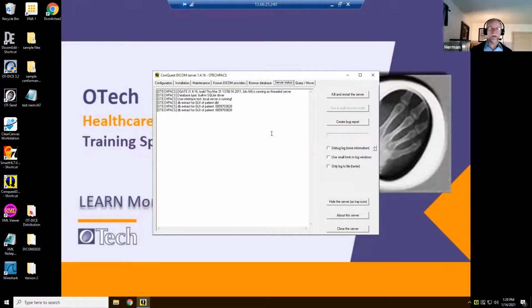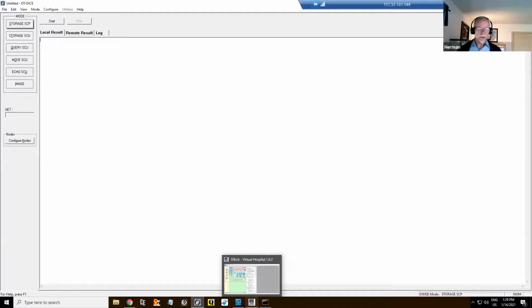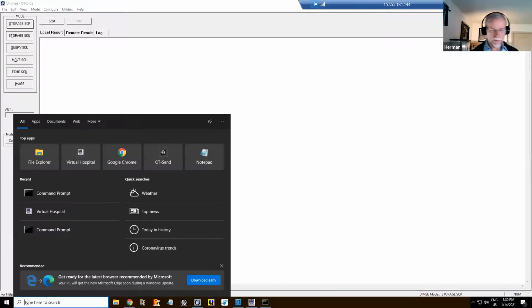Anyway, that is our destination. This is the PACS system that we're going to be talking to. This is virtual machine number 2, and that was virtual machine number 1. We're going to go back now to the modality simulator. Before we do anything, we're going to do a ping just to make sure that we have connectivity, right?